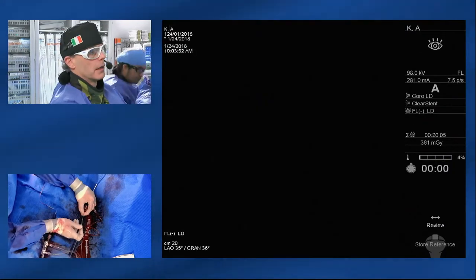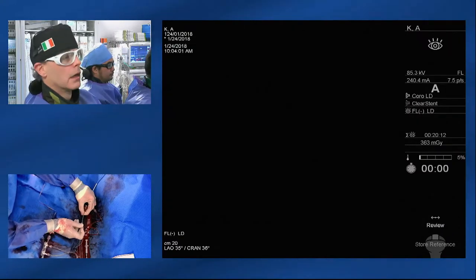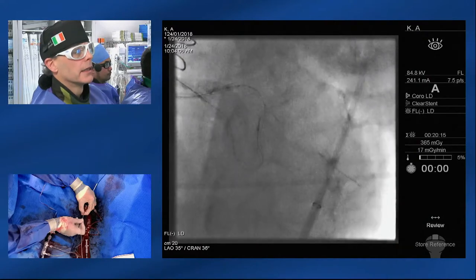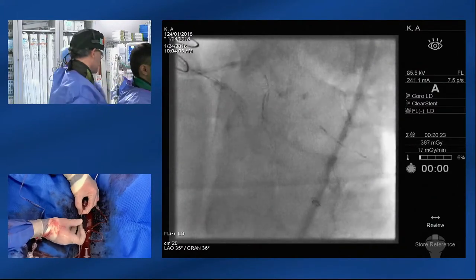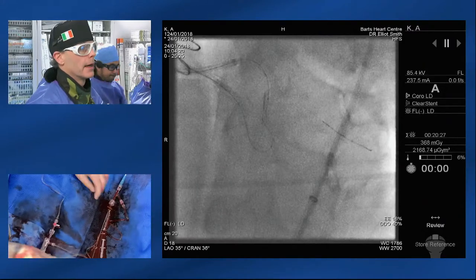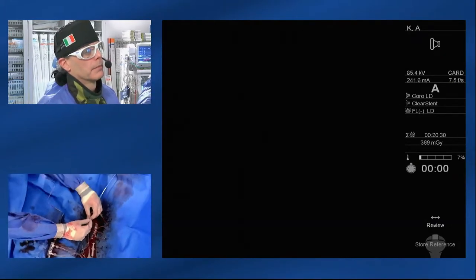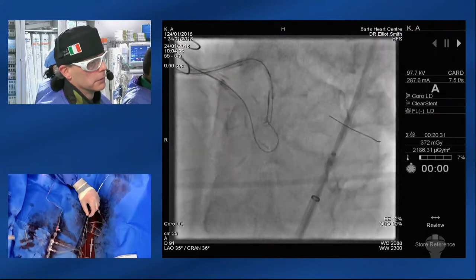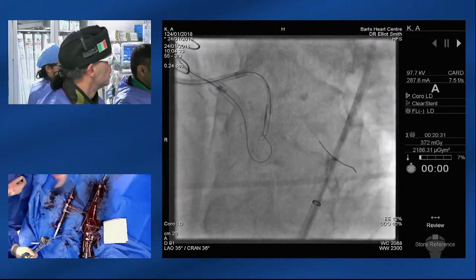They've come down the vein graft and the microcatheter is here. They've gone back with a knuckle to here — so this is now sub-intimal space. This wire is also in the sub-intimal space. The plan will be to put a balloon in the sub-intimal space here, and then take the retrograde wire into the sub-intimal space and then out here. The important thing is that the connection must be made in the sub-intimal space within the CTO body. The wire on the right is the antegrade wire in the sub-intimal space — that's where the balloon is going to go.